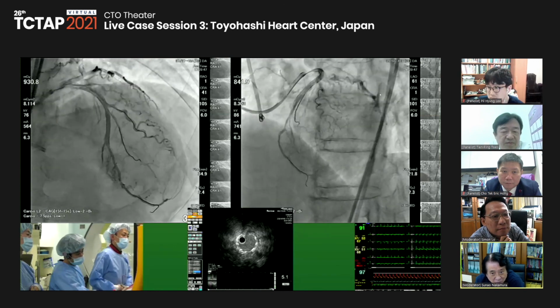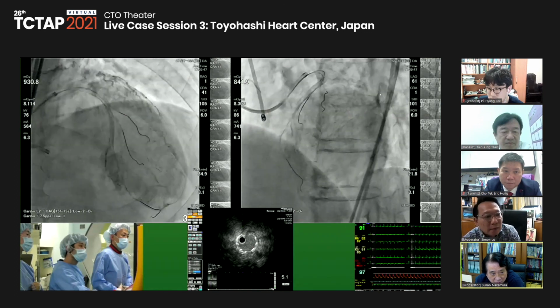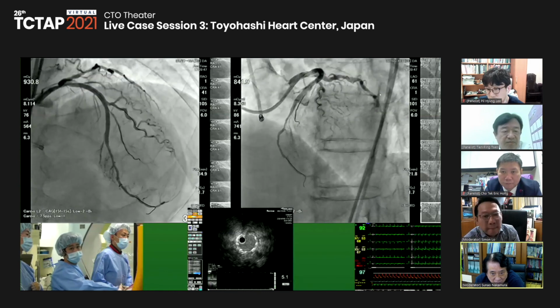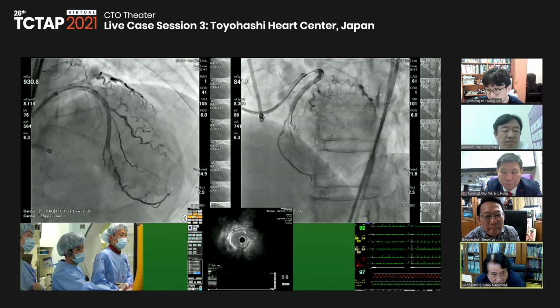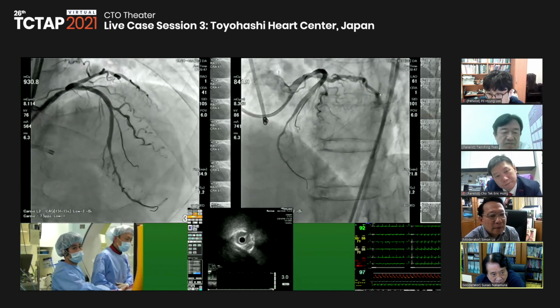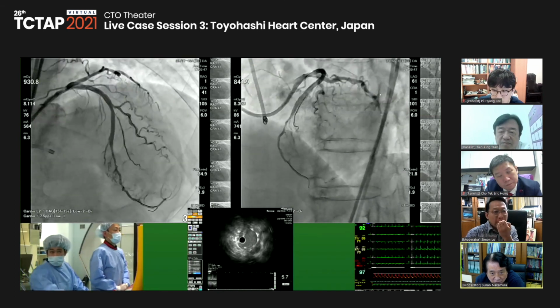He also always shows us we should check two different orthogonal views, like left cranial or true lateral. This is very important. And finally, after wire passing, we should set an appropriate stenting.